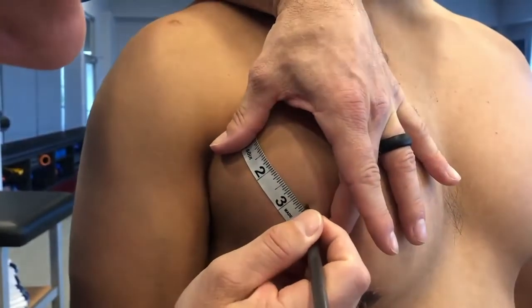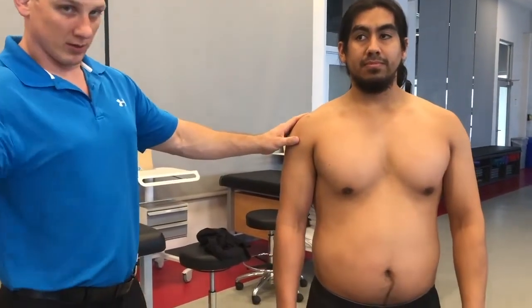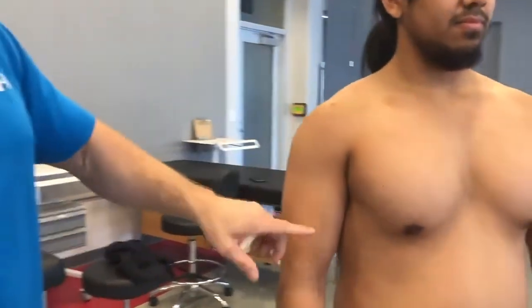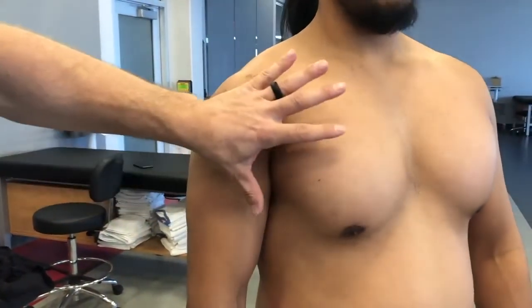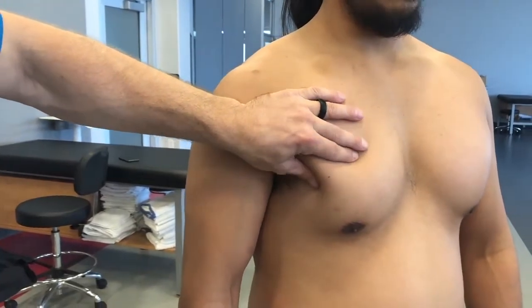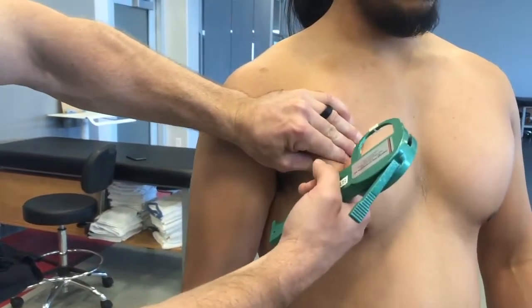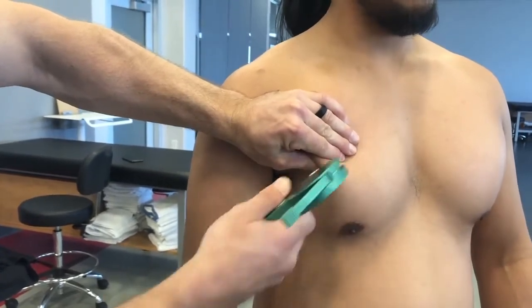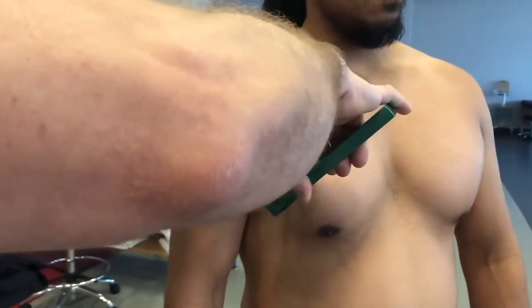We're going to start with our client and do the pectoral pinch. The first thing I need to do is find my mark. I'm going to pinch him very aggressively because my job is to try to pull the fat from the muscle. You can see a nice crest has developed — this line is going to be the midpoint of where my calipers go, on a diagonal.